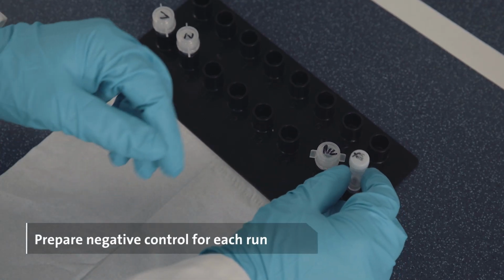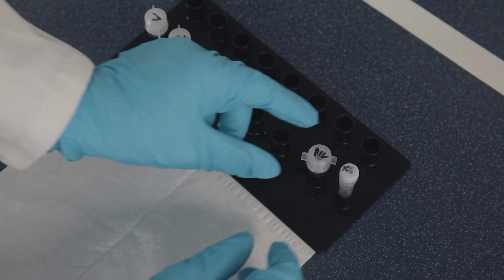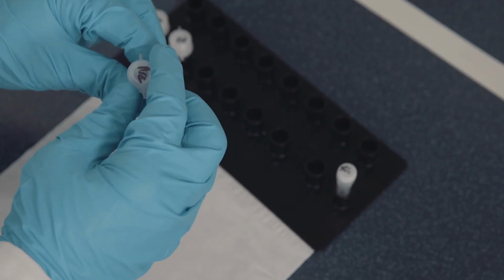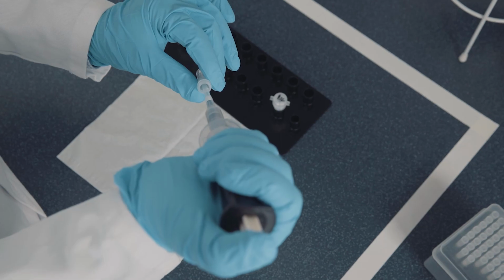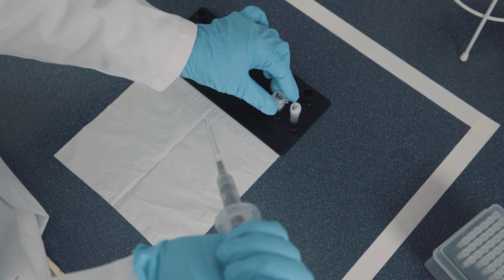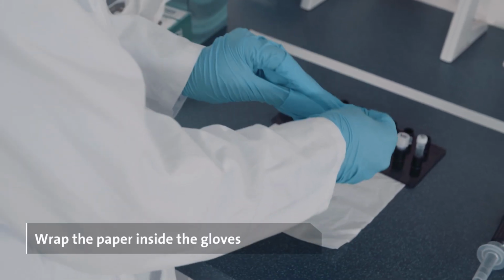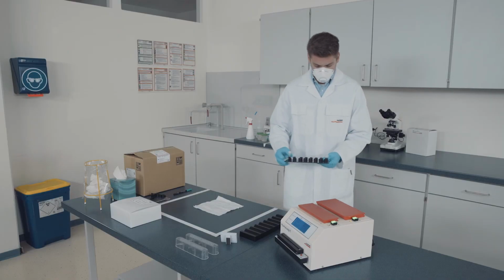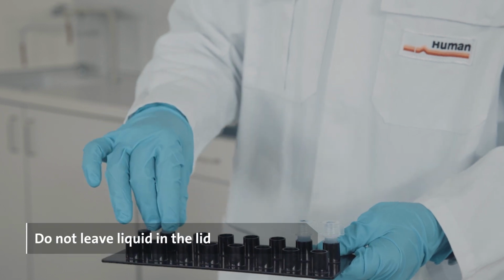Now prepare a negative control for each run to assure a correct processing of the complete workflow. To do so, also transfer 60 microliters of the negative control into the respective heating tube. Discard the first pair of gloves. Now mix the samples by shaking the heating tubes. There should be no liquid in the lid.